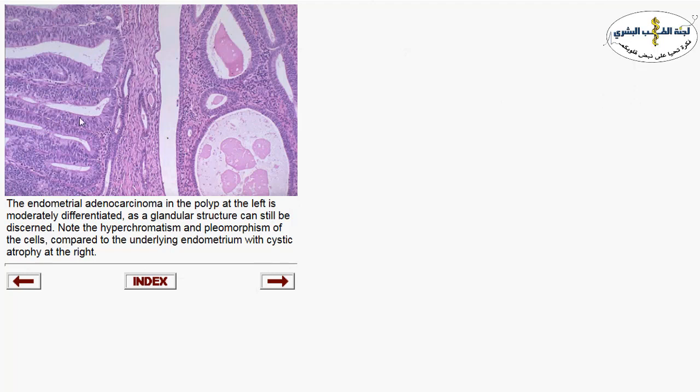In uterine malignancies or carcinomas, we have back-to-back glands with no stroma in between. This distinguishes hyperplasia from carcinoma in the uterus — especially well-differentiated carcinoma — where there is no stroma between glands, along with cytologic atypia, hyperchromasia of the lining epithelium, and mitosis. This represents endometrial carcinoma. On the right side, cystically dilated glands represent atrophic endometrium.